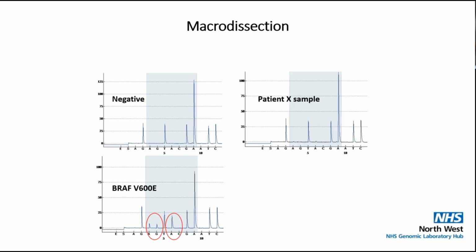This was our patient's sample who was run on the pyrograph. These are the peaks that we would look for to see if there is a mutation. And they do look pretty flat, but there was a slight hint in this case. So we were unsure and we weren't totally convinced there was nothing there, but there was certainly not enough of a change or enough of a peak there to call any change or call that mutation.